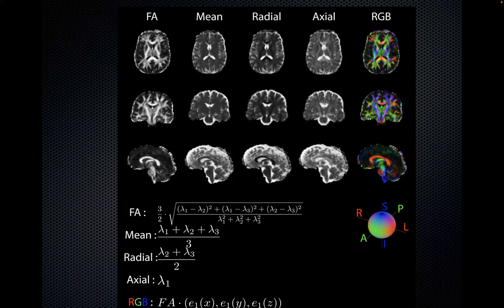So think about disease again. DTI is wrong, but it's useful. Right? So if you have water molecules here, it's not rocket science. It's stupid, but here the axial diffusivity and the radial diffusivity are going down. Sorry, axial diffusivity is going up.